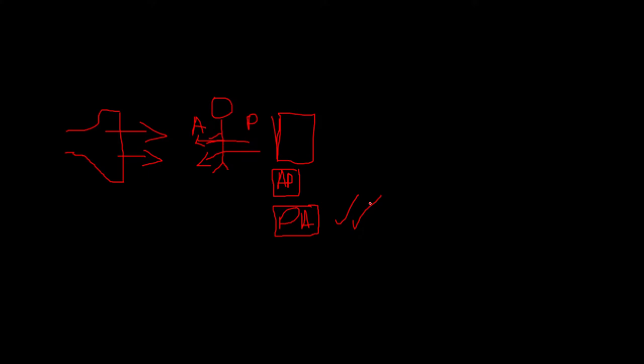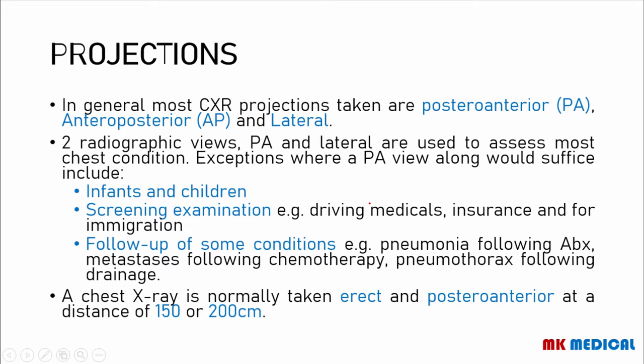And I shall explain why it is so. So let's get back to the slides. So we have a posterior anterior, we have an anteroposterior, and we have a lateral projection.